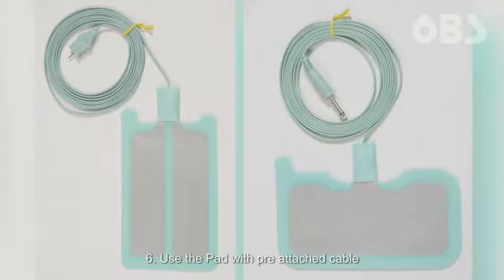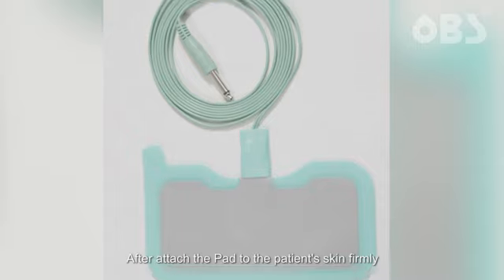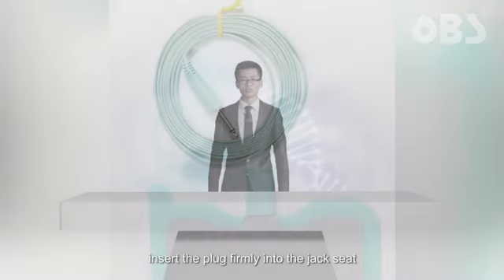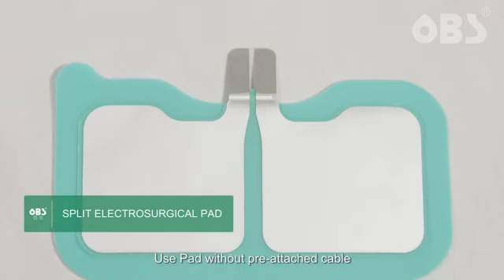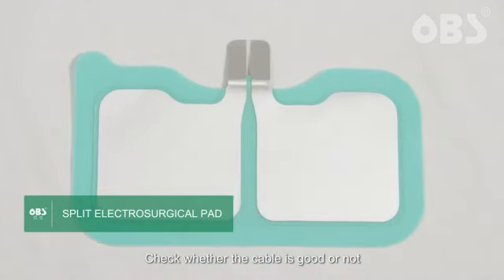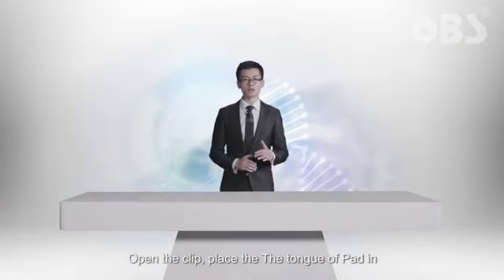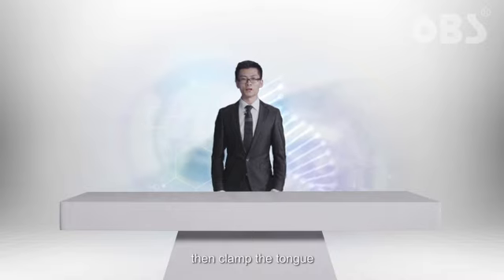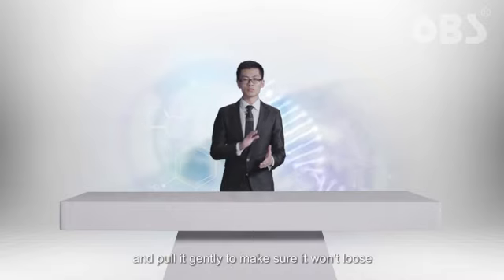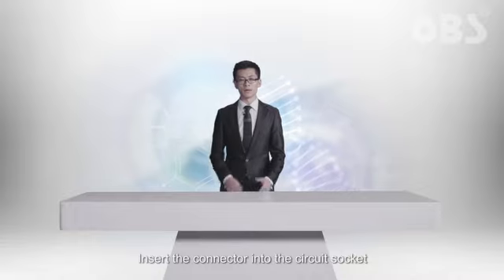6. Use a pad with a pre-attached cable. After attaching the pad to the patient's skin firmly, insert the plug firmly into the jack seat. Use a pad without a pre-attached cable. Check whether the cable is good or not, and attach the pad to the patient's skin firmly. Open the clip, place the tongue of the pad in, then clamp the tongue and pull it gently to make sure it won't loosen. Insert the connector into the circuit socket.